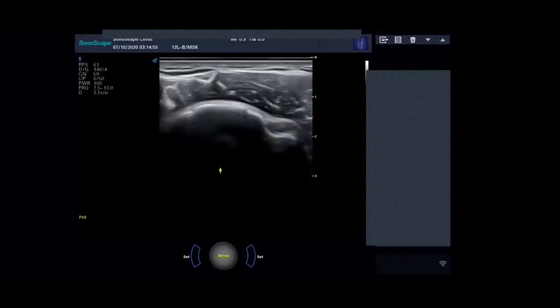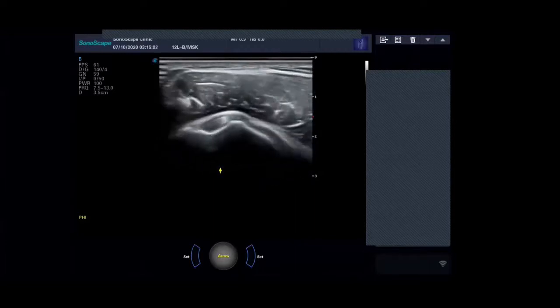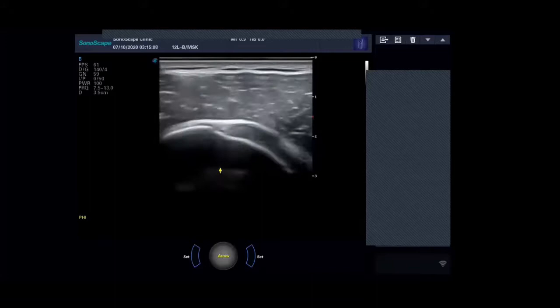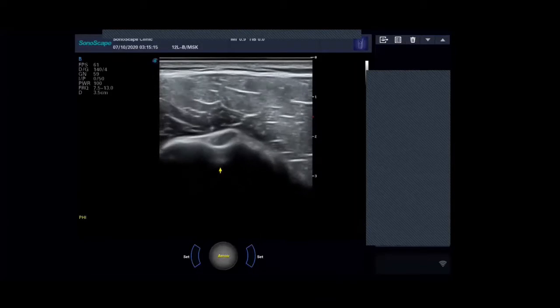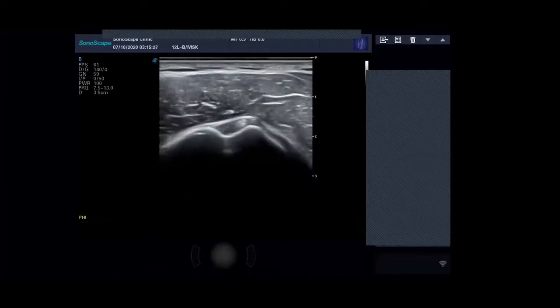So it can sublux easily, and if it does, you've almost certainly disrupted your superior ligaments. So just look to the medial aspect of that, because if it's subluxed, then it will look like this, and it looks like the groove is empty. And it's not that it's ruptured, it's just that it's subluxed. So you just need to come immediately to see if it has subluxed out of the groove.